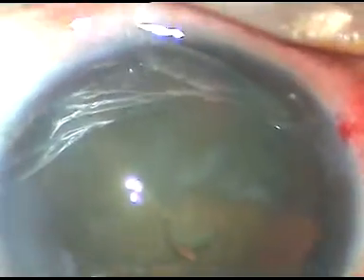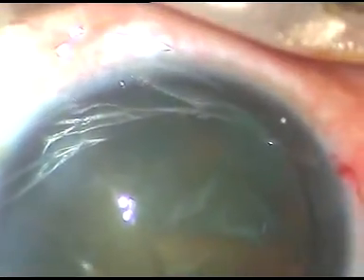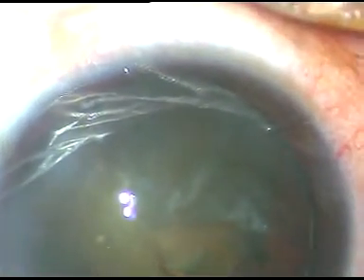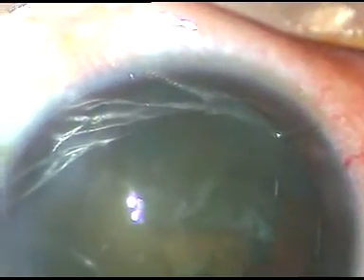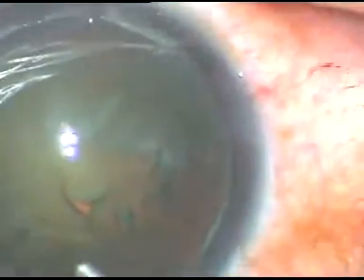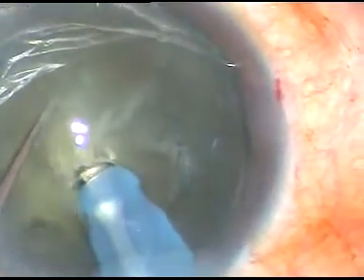I usually do a larger rhexis. This rhexis has been about 4.5 millimeter or so. I usually do a rhexis of about 5.25 millimeter or 5.5 millimeter. Now, at this time I don't want to enlarge the rhexis. I just want to manage the nucleus with this small rhexis. Here it is.